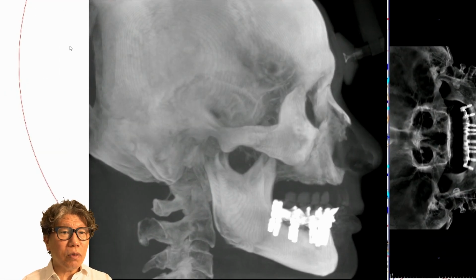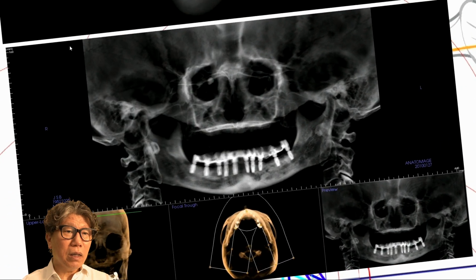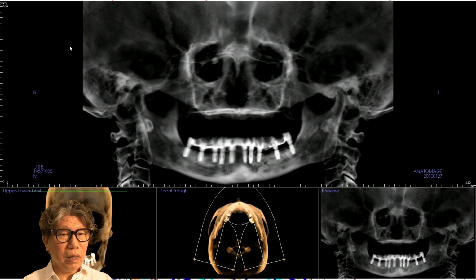Another patient, but he has also been receiving treatment for quite some time. So as of now, it's all on X. All on X, but in the past it was called a fully bone-anchored prosthesis. About 30 years ago, there was a book that introduced a lot of these new technologies, to the Brånemark implant. When he introduced such new technologies, there was also something like this. At that time, there was an abutment called the aesthetic cone. We now call it a multi-unit abutment.